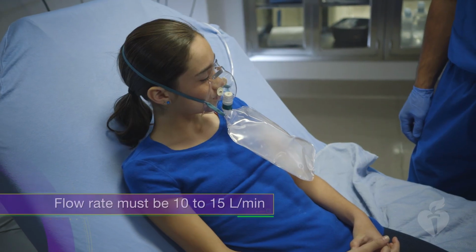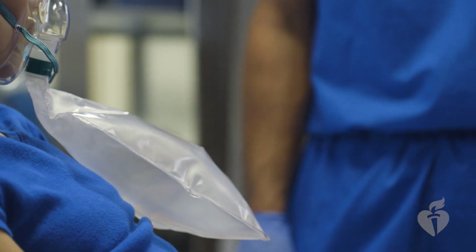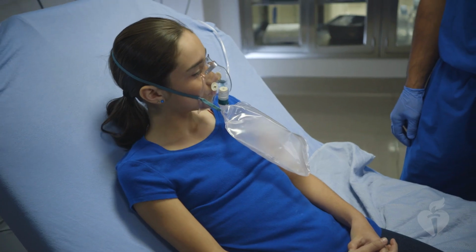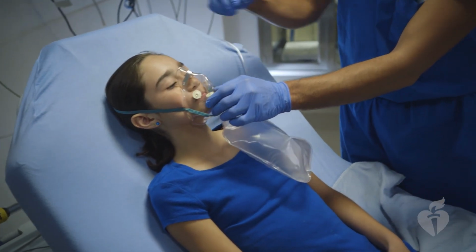The oxygen flow rate for the mask must be at 10 to 15 liters per minute. The flow rate should be adequate to keep the reservoir bag partially expanded. If the mask is tight-fitting, one-way valves ensure the child breathes only oxygen from the oxygen source or the reservoir. No room air is drawn in. Non-rebreathing masks should be used in emergency settings when the patient is breathing spontaneously, but high concentrations of oxygen are required to maintain oxygen saturations.